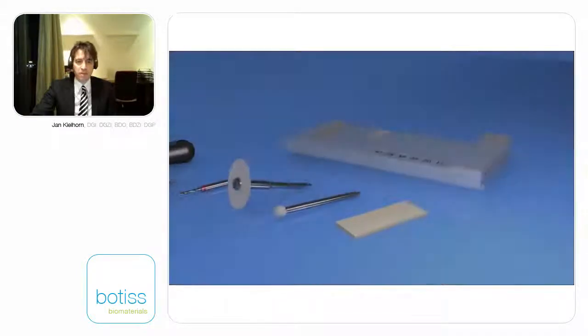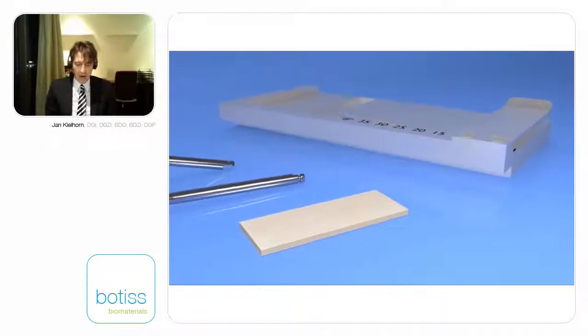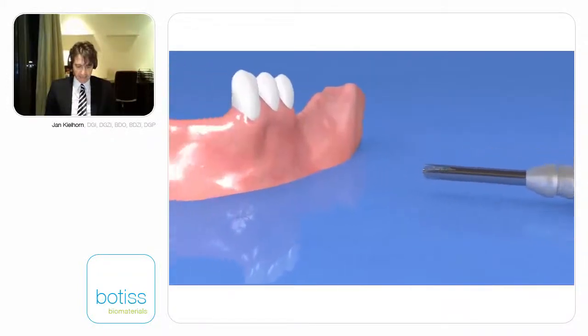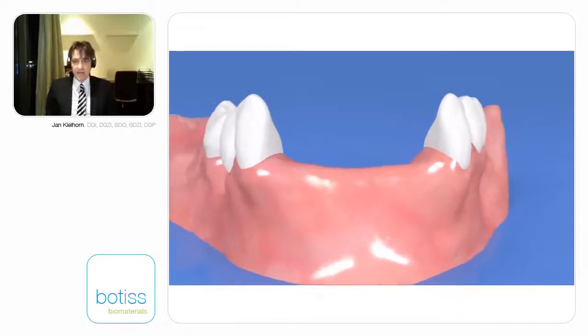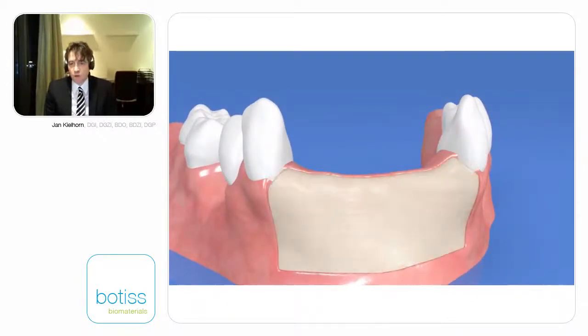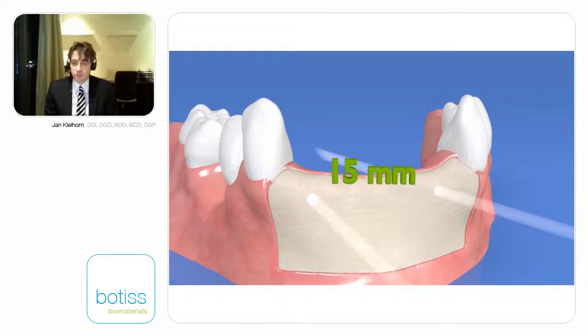For the bone plates, I will now show you a movie of how this functions. And with the movie, you will see that we designed a sort of paper cutter. We have this prefabricated cortical strut, which is from allograft, and which is sterile.